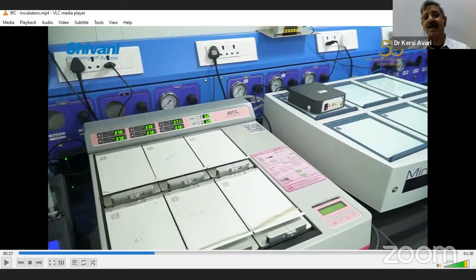So what happens? These are known as lab guard systems or monitoring systems or lab health systems, which will make you aware of the temperature, of the humidity of the lab, of the nitrogen levels in your cryocan cylinders, of the carbon dioxide levels, or the temperature in your incubators.